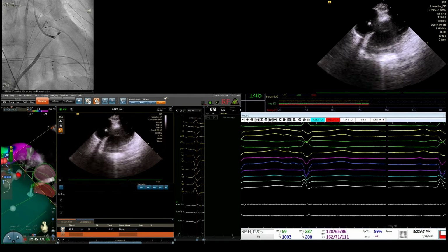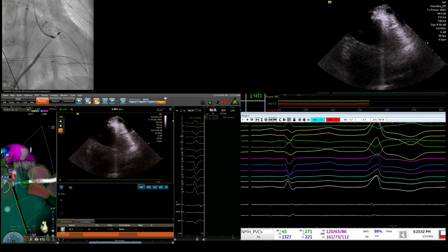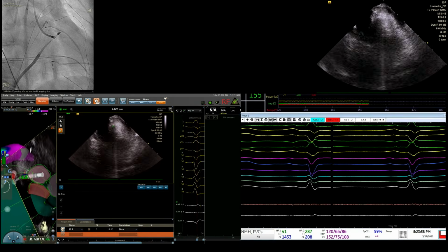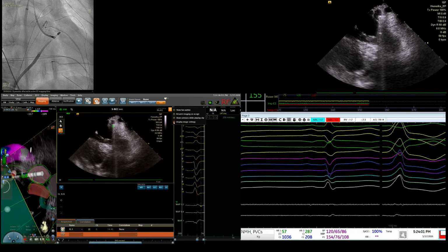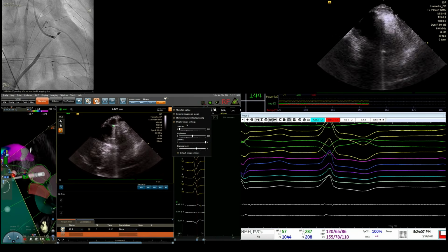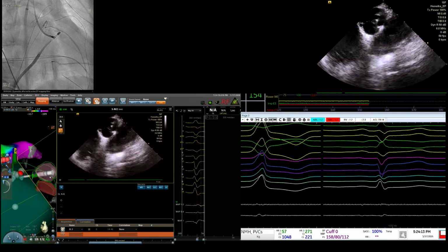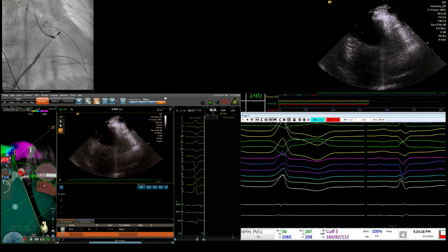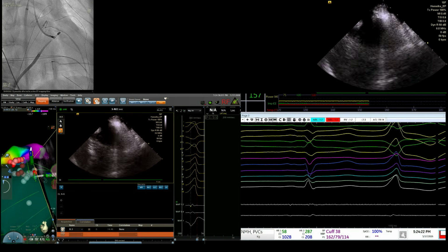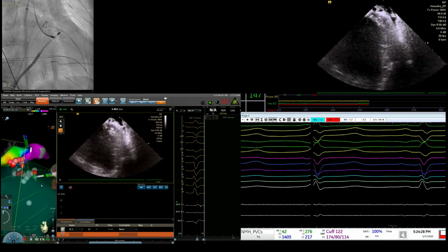There is the left coronary cusp right there. Don't see much of a signal, to be honest with you. That's the bottom of the left coronary cusp right there. You see the catheter? All the way to the bottom of the left coronary cusp. So maybe even that lesion gets to there, because you can see the whitening on the tissue when we go a little below. So I think that this is left coronary cusp. The morphology looks a little different, but it's still very basal. So my guess would be go a little bit more lateral, which we will do, a little bit more septal from our lesions, or really the difference is to just do a deeper lesion here, if that's what it comes to, because it's right in the middle, and this is the challenge of this.